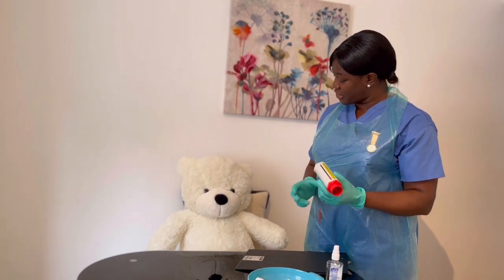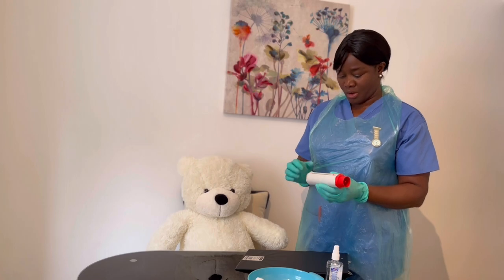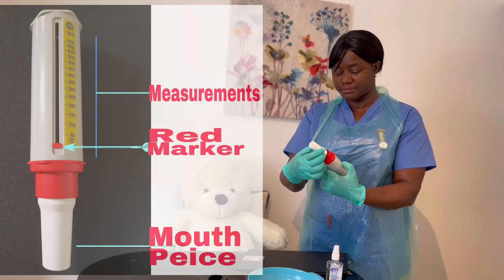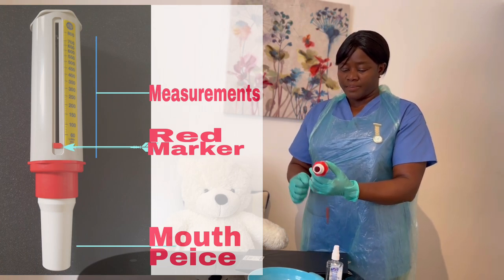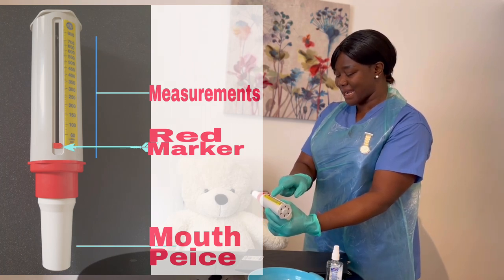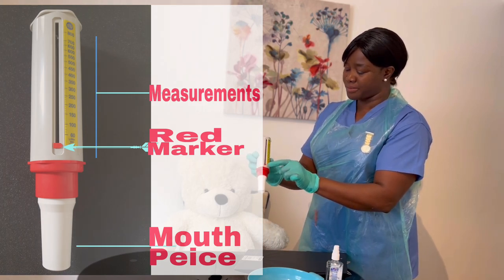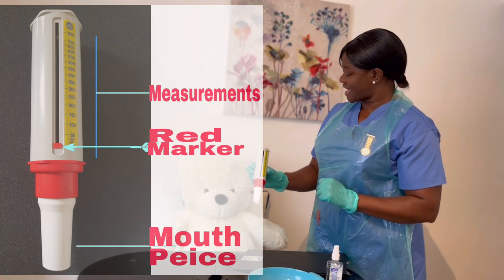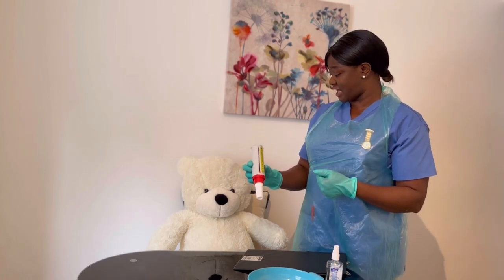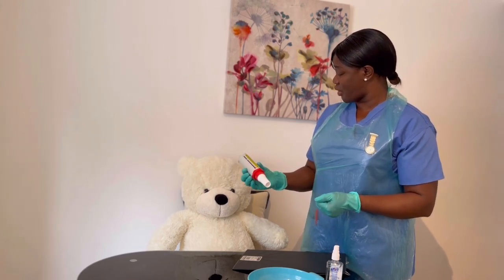Harry, when you take your peak flow reading, you need to sit upright or stand upright. You need to connect your disposable mouthpiece. You need to hold your peak flow device facing you in a horizontal manner. Ensure that the marker — the red pointer — is at zero and make sure it slides down to zero. You can take your peak flow reading in the morning after taking your inhaled medication, but that should be 30 minutes after. You can also take it at night or in the evening. Those are the times you can take your peak flow reading.